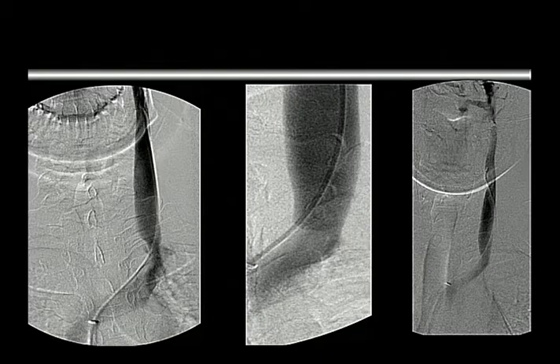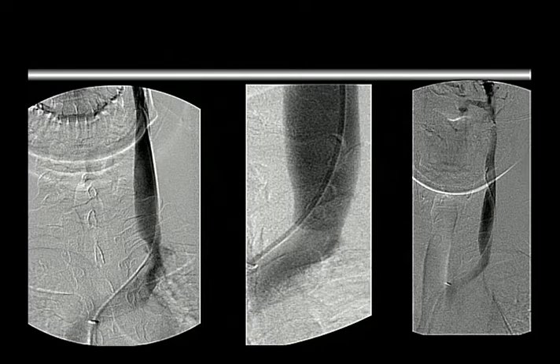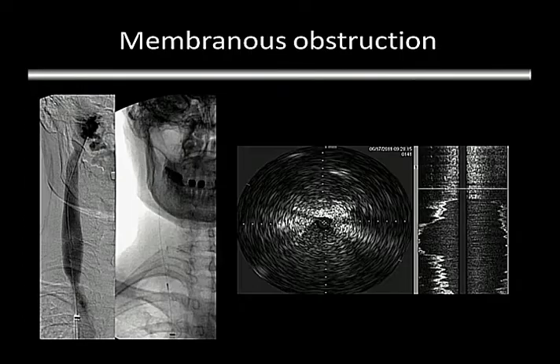These are all areas of stenosis, and the question came up to me is, well, what do we treat? How do we treat? Which is significant? And I can tell you that they're all about the same degree of stenosis. Every one of these. This one looks more obvious. Here, you can see a stuck valve and contrast filling around the valve stuck in that position, a significant stenosis. This is one of those cases where the contrast media gets through this pinpoint hole, refluxes back in this direction, and hides the stenosis. And this one, I don't even remember, but this is a significant stenosis that's well hidden in that vein. So it's possible to identify all those.